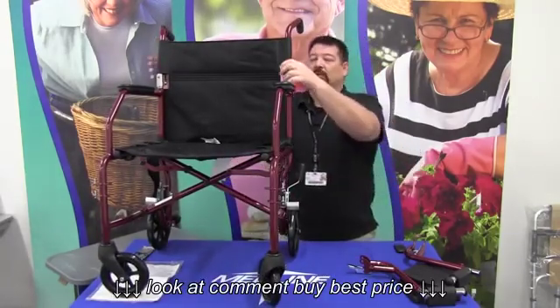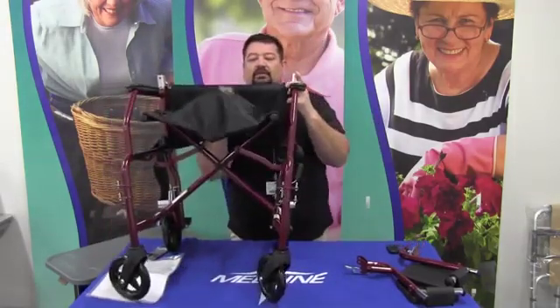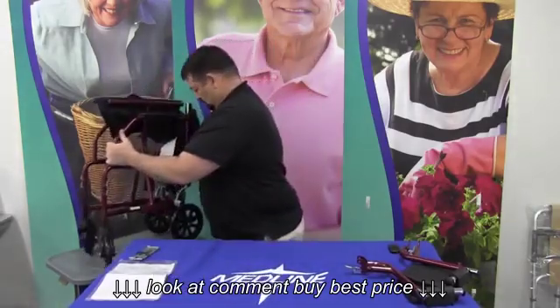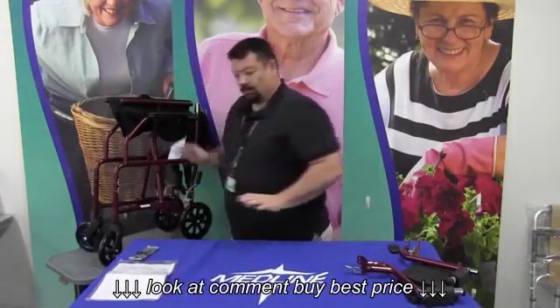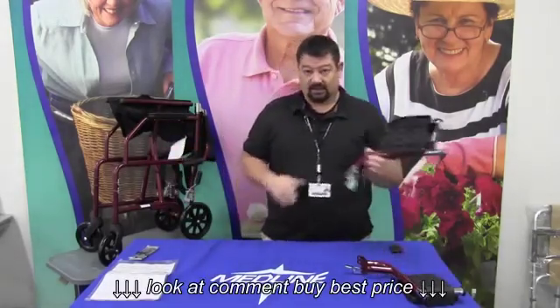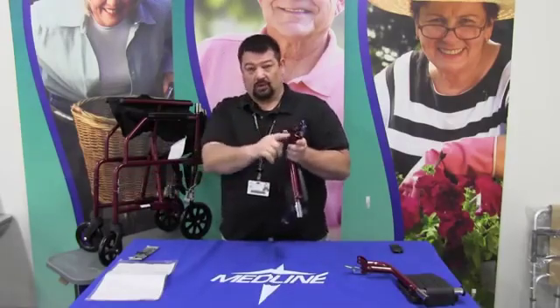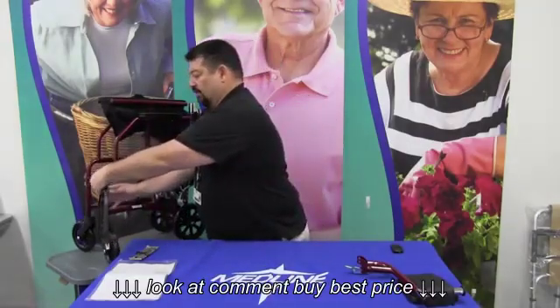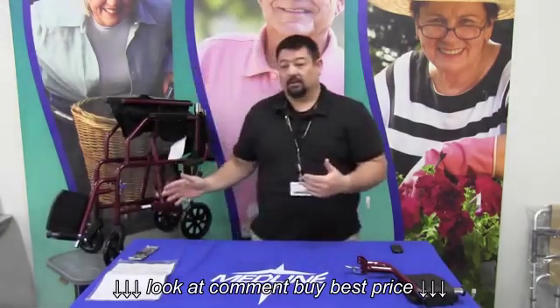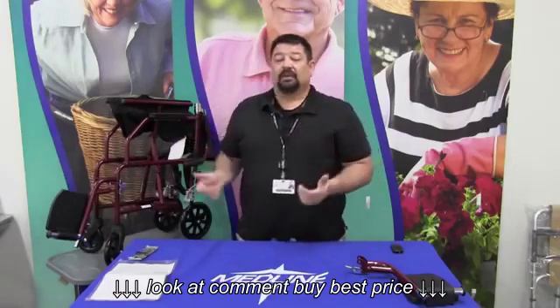At this point, have the person who's going to be in the chair sit down. Attach the legs — there are two silver posts on the outside and two holes on the bracket, one over the other. Slide it inside and it locks into place. Once it's locked, they're not going to move. Have them sit down.